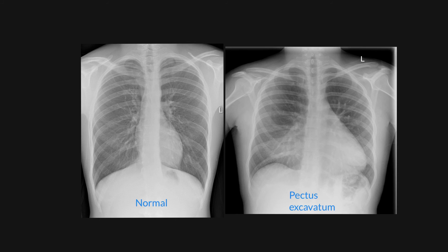This illustrates the normal film where you can clearly see the right heart border. In the patient with pectus, it is abnormal and hazy, and you can see that the orientation of the ribs is significantly different from that of a normal chest x-ray, or from a chest x-ray demonstrating right middle lobe collapse.